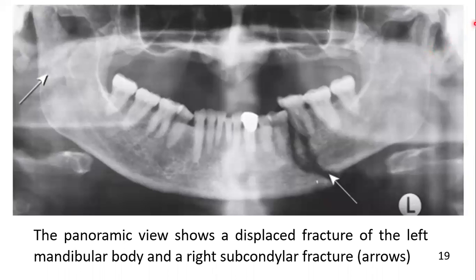Now let's see the significance of two radiographs taken at 90 degrees to each other, and the significance of the reverse Towne view with respect to the OPG. Here you can easily appreciate the fracture in the body area and also a fracture in the subcondylar area.